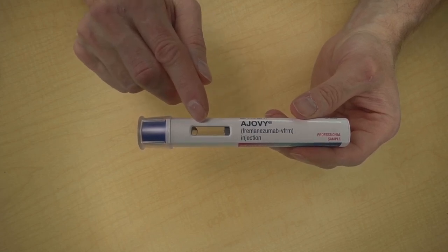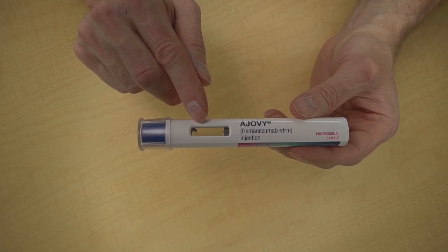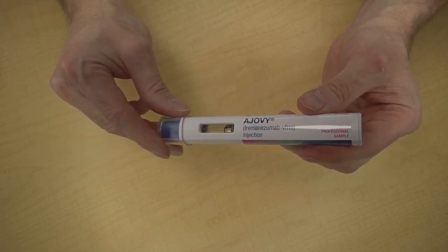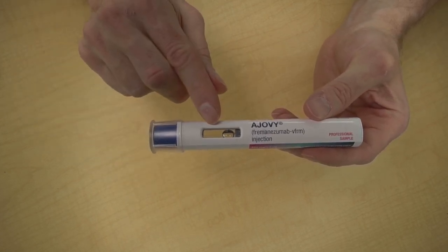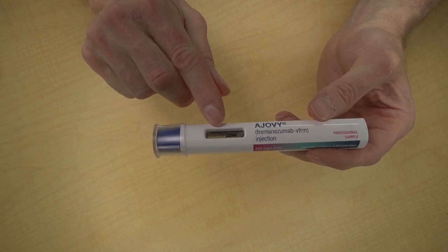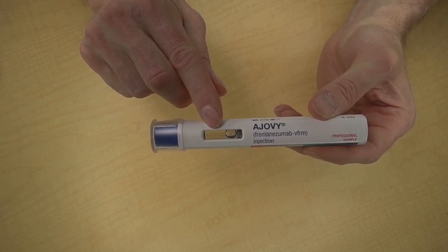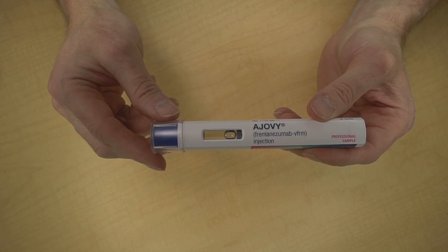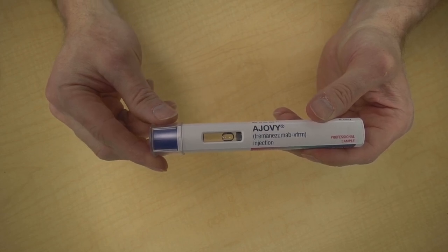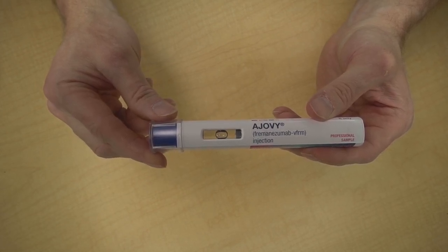Looking inside the viewing window, the Ajovi should look clear or slightly yellow. It's okay if there's a bubble. But if the Ajovi looks cloudy, if the glass looks broken, or if you see anything floating in there other than a bubble, call the pharmacy or Ajovi at 1-800-887-8100 to get a replacement.